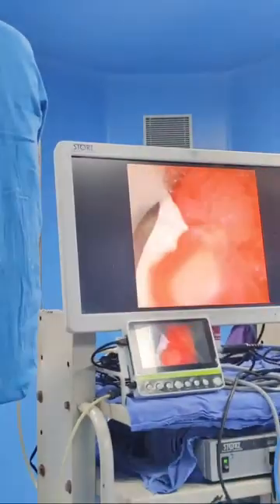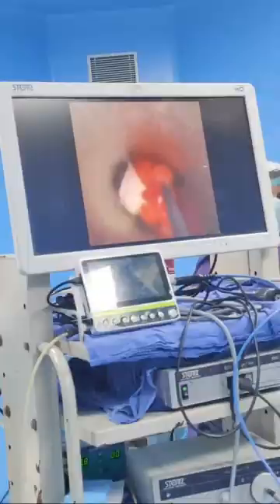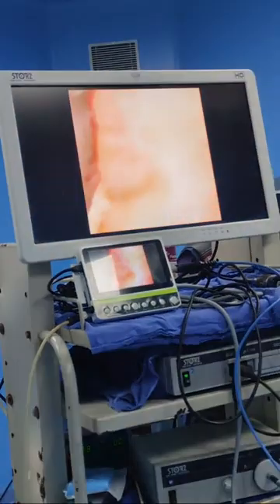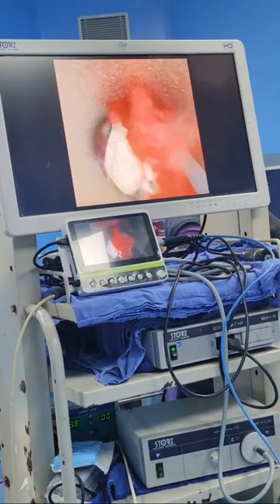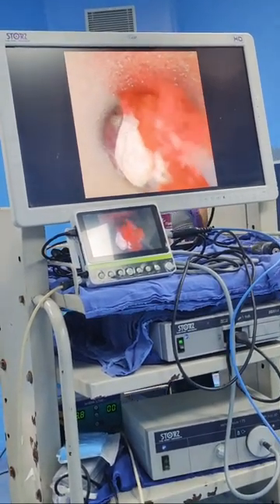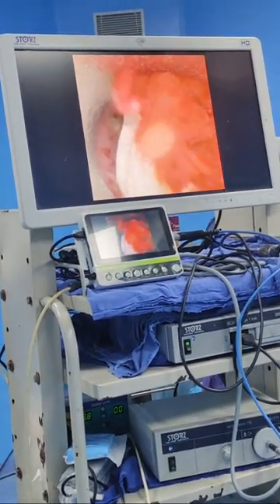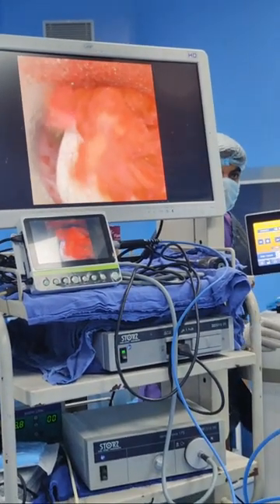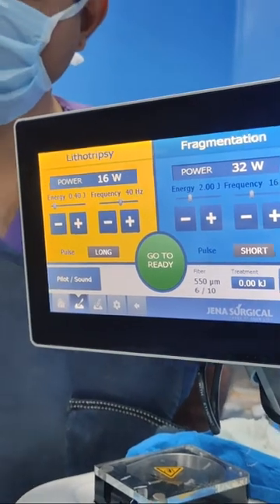We'll start fragmentation. Pneumatic, please. Or you can give laser right now. Laser, let's see with the laser. 550 fiber? 550. Right. So we have a laser. Just show the laser machine. This is from Jena, a German made laser that we have got in our department for demonstration. So let's start.